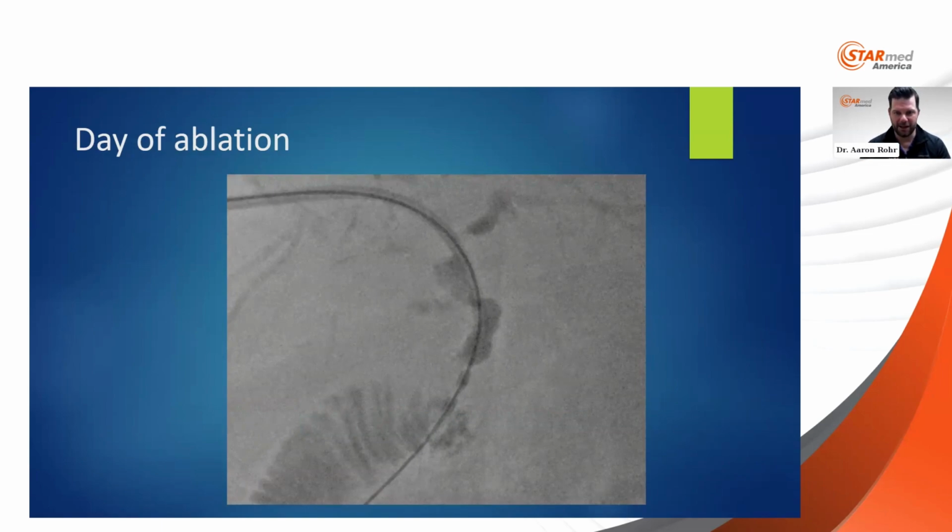And then this is the 11 millimeter ablation device. And again, it was nice seeing that visual provided by StarMed earlier because it shows you the exact ablation zone that you would expect around this. So obviously here's the area of narrowing, just juxta to it is going to be our ablation zone and deep to it. I will say the workhorse in our practice is certainly the 11. A majority of our benign biliary stricture protocols are due to anastomotic strictures. They are typically very focal. So this is by far the workhorse for us.